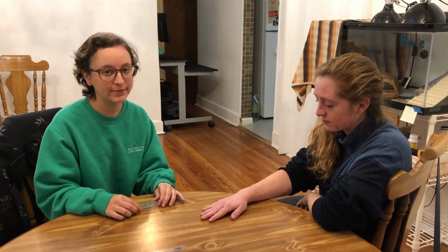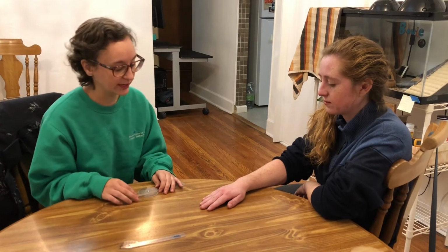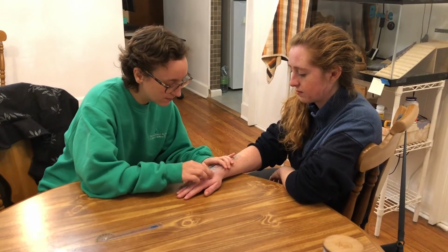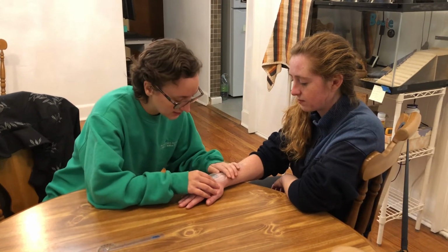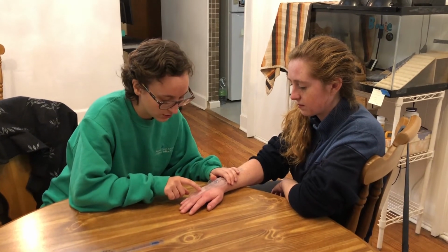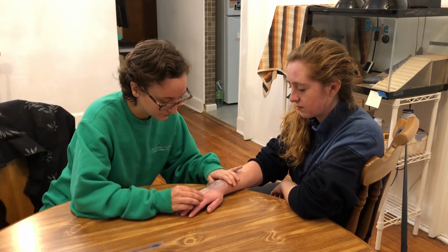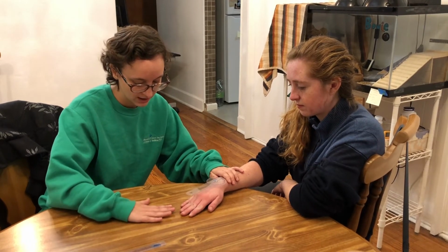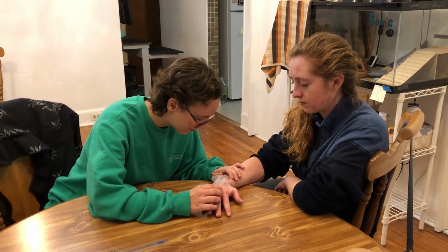Now I'm going to do goniometry of the wrist. So first I'm going to start out doing radial and ulnar deviation. I'm going to have my stationary arm in line with the forearm, and I'm going to have my fulcrum right above her wrist. And I am going to line up my movement arm with her middle MCP joint. And what I'm going to have you do first is bring your thumb over to the side, over by your wrist, as far as you can.